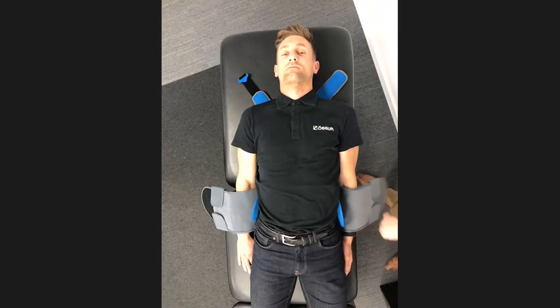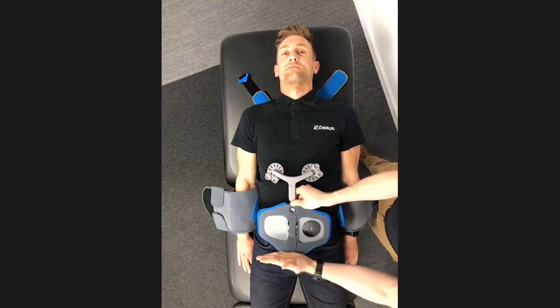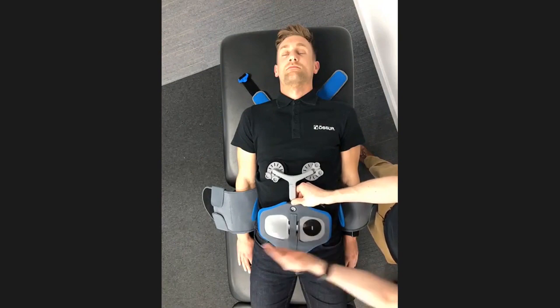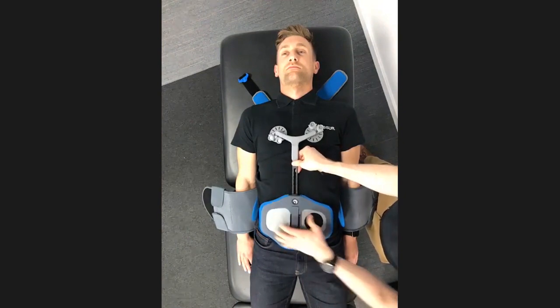Okay, so we're now going to fit the anterior thoracic extension. So what we would do is just adjust this at the front. Anatomically, we're looking for symphysis pubis, but what we want to make sure is if the patient was to flex, it's not going to make contact with the top of the flexed thigh. And we're just going to slide this up into position.